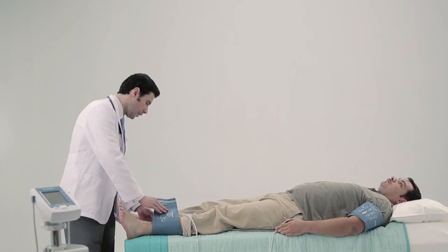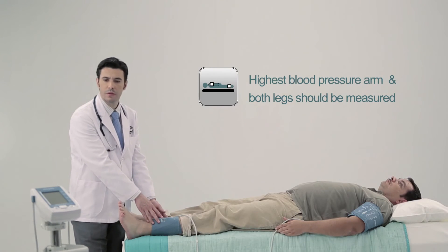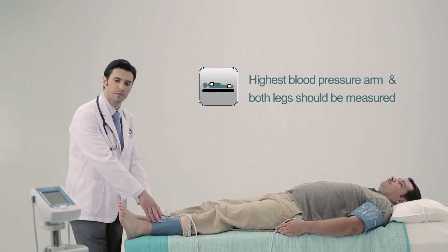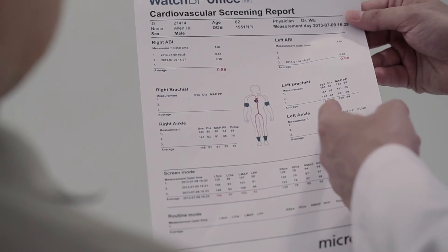The arm with the highest blood pressure and both legs should be measured. Average time for a single automated ABI assessment is only four minutes with Watch BP Office ABI — less than half of the time compared to Doppler measurement.